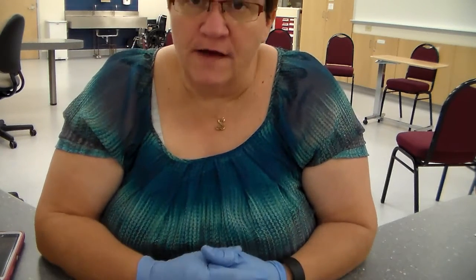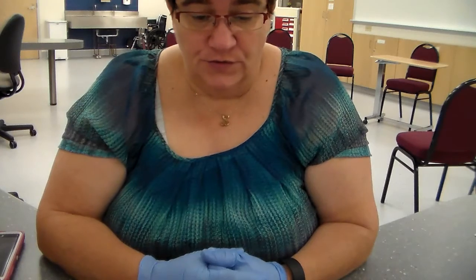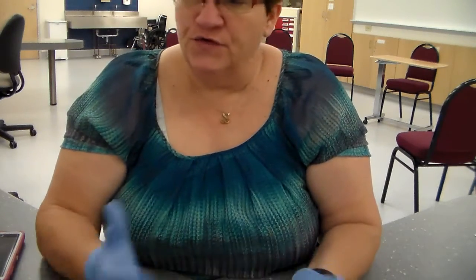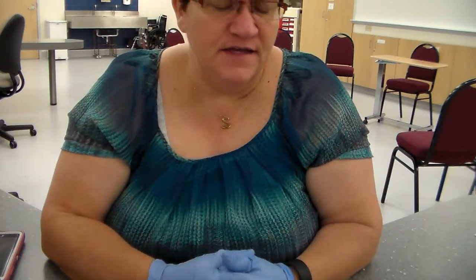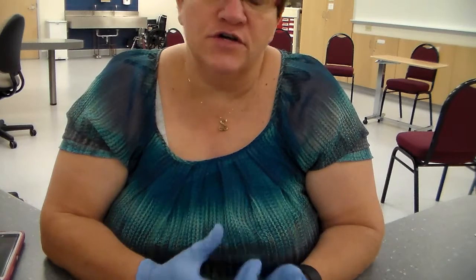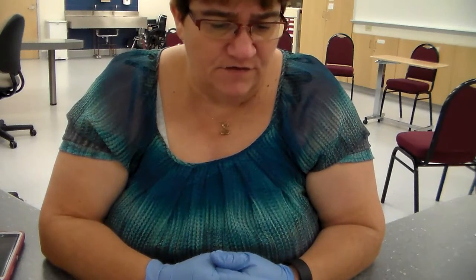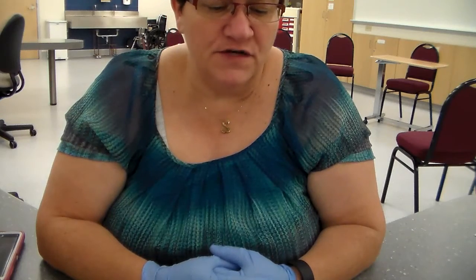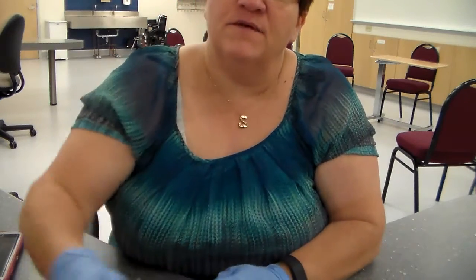You're going to remove your gloves. You are going to make sure that the patient is comfortable. Do all of your necessary wipes at the end, and then you're going to wash your hands and document anything that you just did for the patient. Okay, so that is skill 2.31, administering dry powdered inhaled medication.